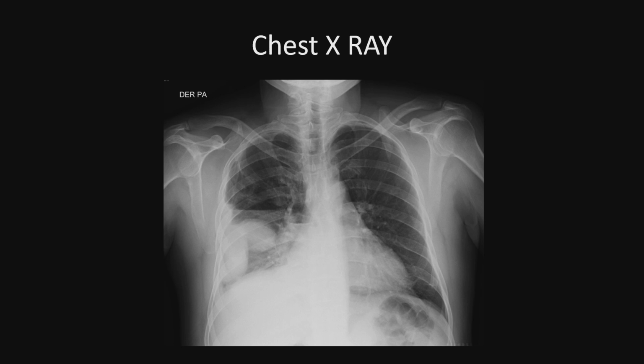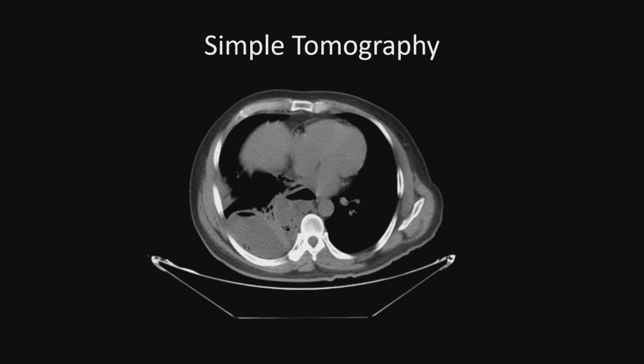So we requested a thorax CT, and it was taken. Because of a recent renal failure, the CT had to be made without contrast. But this didn't obscure our diagnosis, since it was clearly an empyema with an air-fluid level, an infection indeed. As you can see here, there's the air-fluid level, and we have some thickening of the parietal pleura. As well, it looks lobulated, so it's an empyema with an air-fluid level in the base of the right lung.